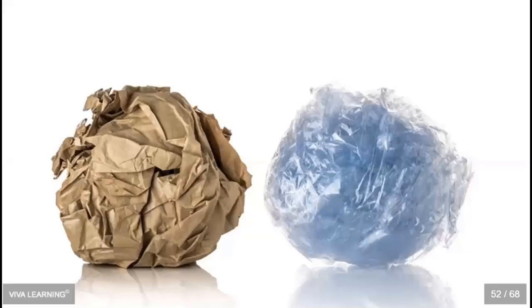Now, that's best practice. And some of you may say, well, we do horizontal loading in our office. Look at your sterilizer manufacturer's manual, instructions for use, because they will specify that if you are choosing to do common practice, meaning horizontal placement, many of them are saying it is plastic side up, and you have to make sure that it's in a single layer. They cannot be overlapped. They should not be touching the side of the chamber.